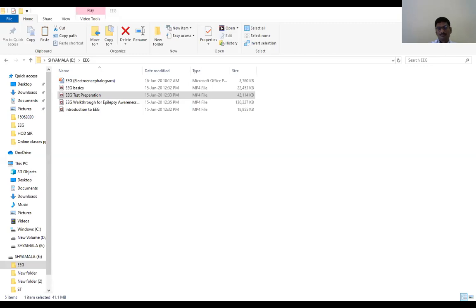Collodion has a strong smell of ether and makes the surface stick very tightly when air is applied and the glue is dried. The air we use is simply room air with tubing attached and a stylet on the end. It is comparable to a hair dryer, but with cool air coming out.